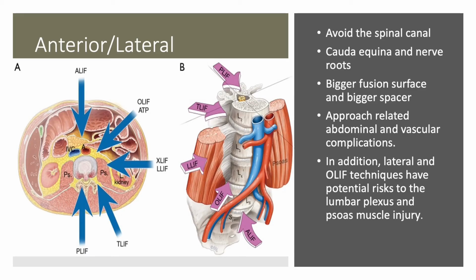Now let's look at the anterior or lateral approaches. The advantage of an anterior approach like ALIF or a lateral approach like OLIF or the XLIF is that it avoids the spinal canal.